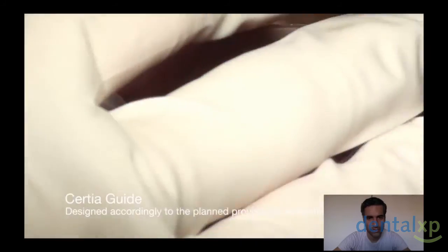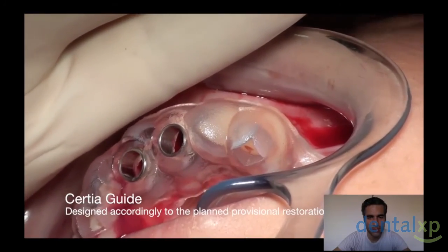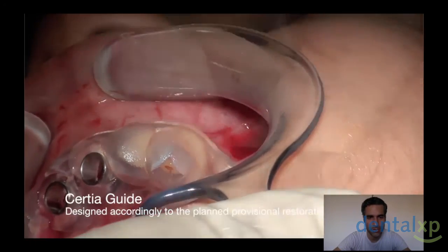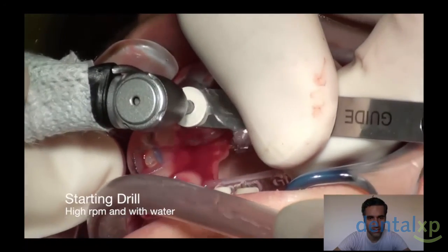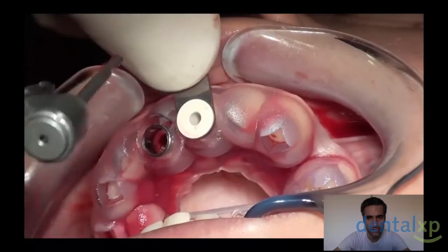And we are going to start drilling. We have to make sure that the guide is in place. We have to be sure that the guide doesn't have any kind of micro motion during the drilling process. That's why I always place one finger over the guide just to hold it during the drilling process. It's very important.